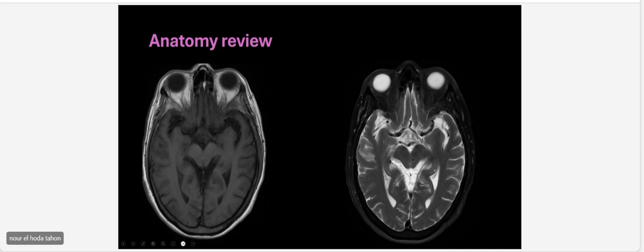And this is named the circle of Willis. Also, you can see the basilar artery tip start to give you the posterior cerebral artery right and left. So this is the area of the circle of Willis and this is an important cut.